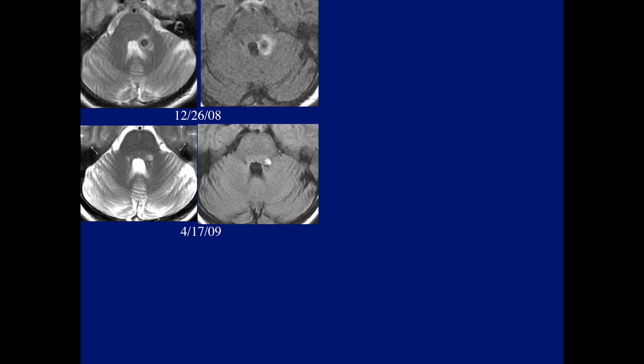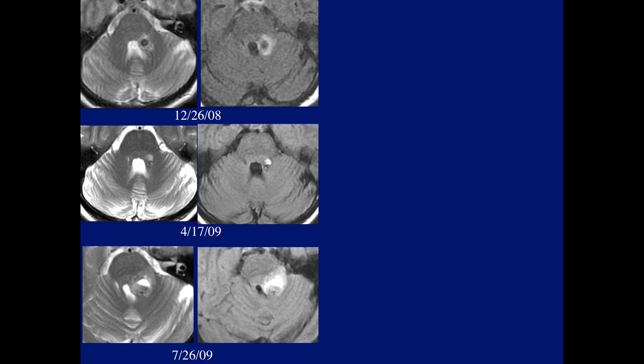Here's a patient who in December of 2008 had a bleed in the cerebellum, the middle cerebellar peduncle next to the fourth ventricle. Four months later we can see resolution of some of the bleed with just a small residual with less deformity of the fourth ventricle. However, in July the patient re-bled, likely from a cavernoma.